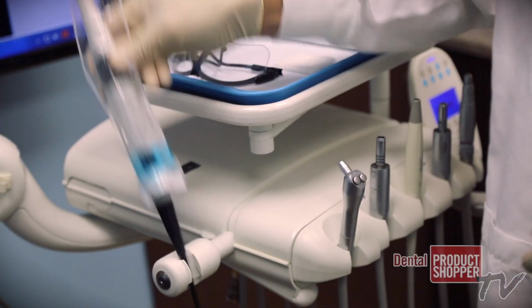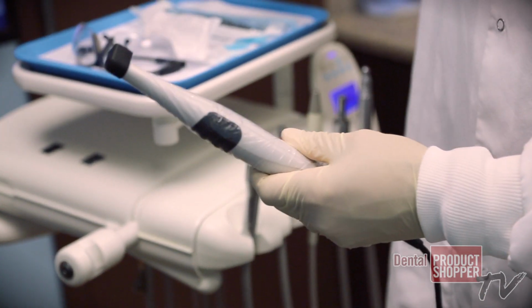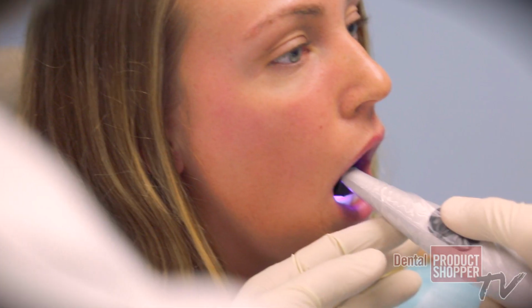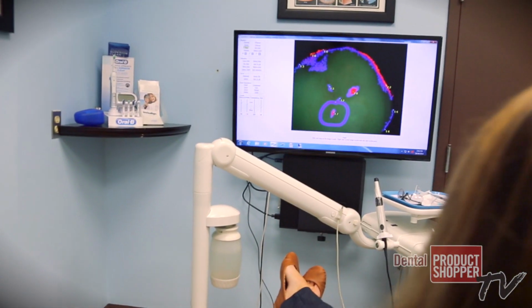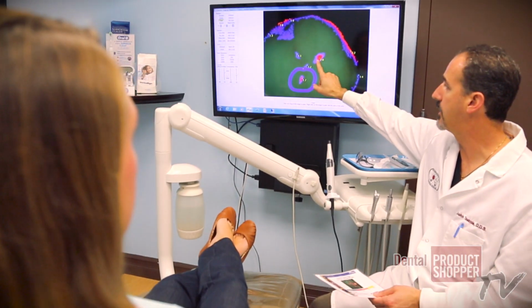And so the Spectra, because of its analysis, is able to determine the depth of the bacteria within the tooth structure. As a practitioner, I'm able to tell a patient, yes, you have a cavity, and this is approximately how deep it is, and this is why we need to move forward with doing it. If it's just a stain and using a regular camera, I am unable to do that, and therefore the patient may not know how severe the situation is.